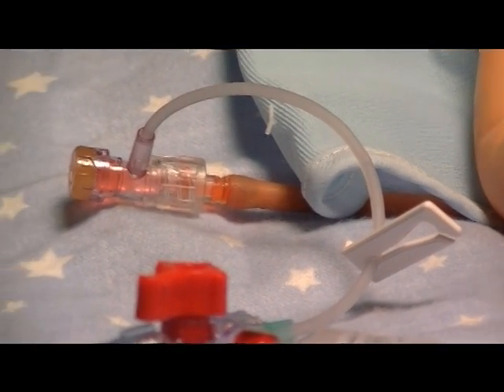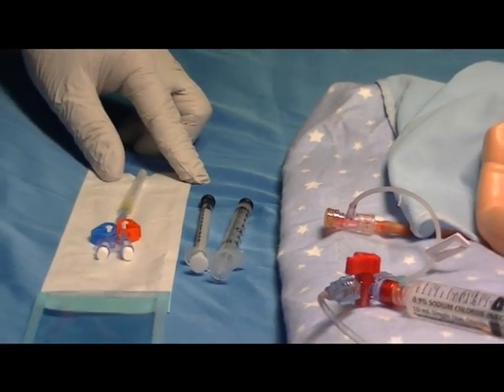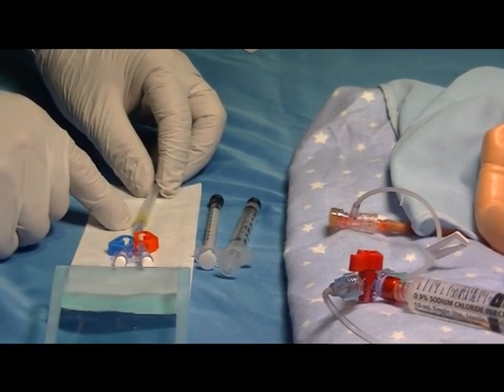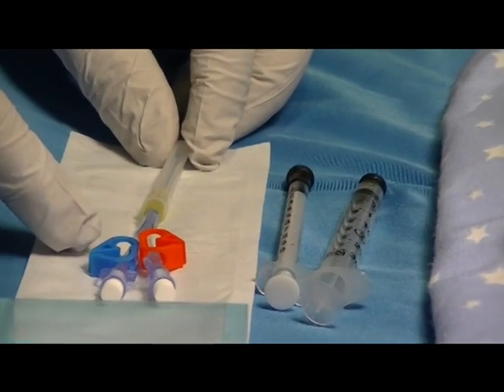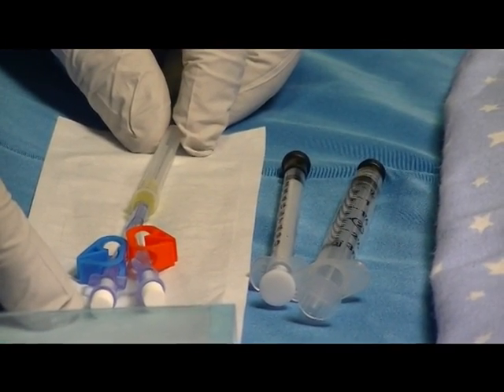Next, go to the Humi Microdraw device, open it, and inspect it for integrity. Be sure that the sterility cover is on the blunt tube, the red and blue clamps are in place on the lines, and the white vent plugs are also in place.